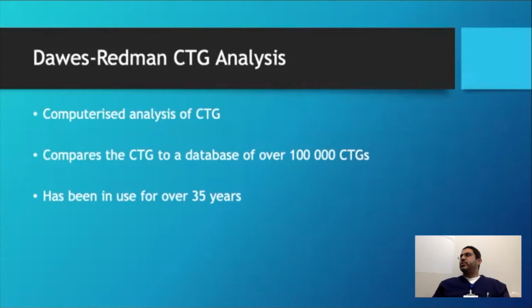If you are trying to figure out whether this baby is well with hypoxia or with hypoxic events, so the contractions, the cord compressions, this is not your tool. It's not designed to look for that. Okay? So that's the very big limitation, which is why here comes the gray area. So I am inducing someone, they're just about contracting. Can I use it? Can I not use it?